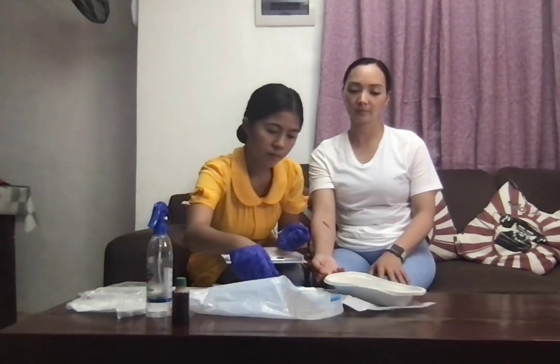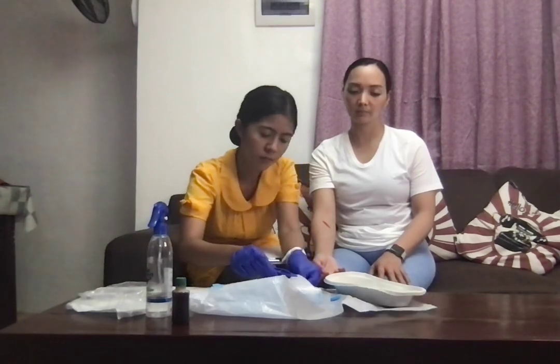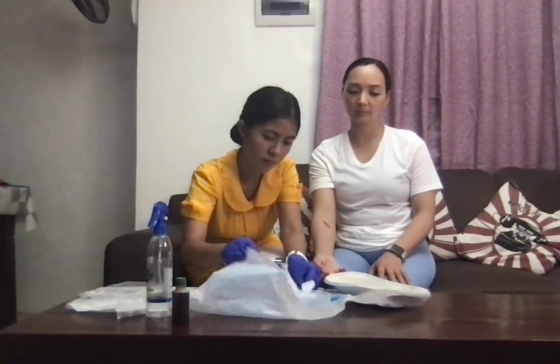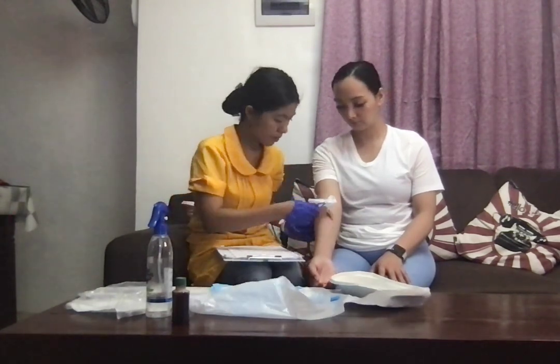Once the wound is clean, I'm going to dry the area using a gauze sponge in the same manner. And I'm going to apply an ointment or even betadine using sterile cotton pledgets or perform other treatments as ordered by the physician. Ita-dry ko lang po.